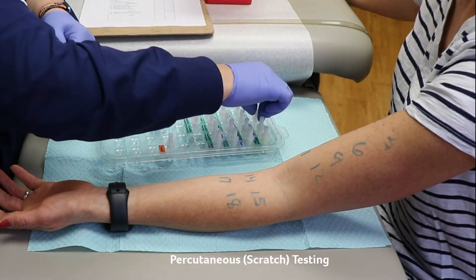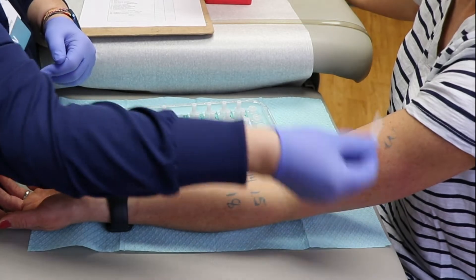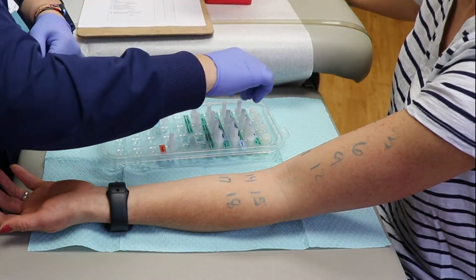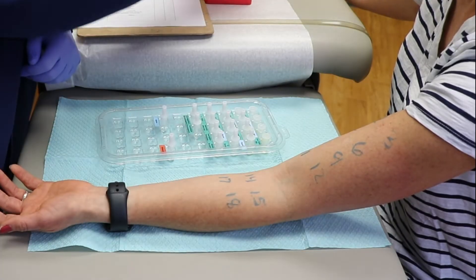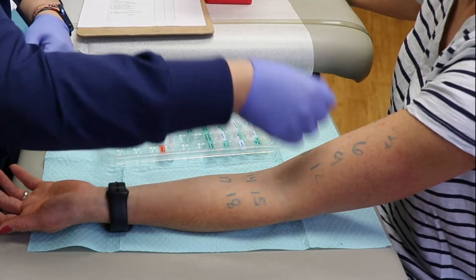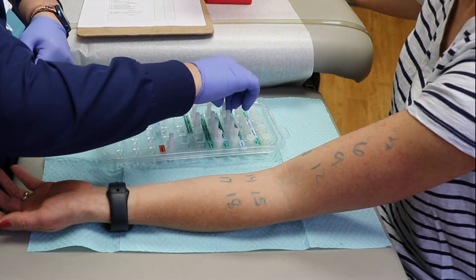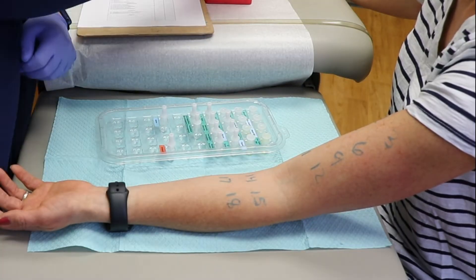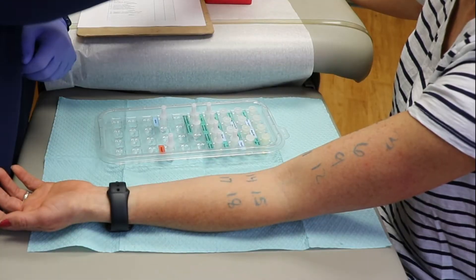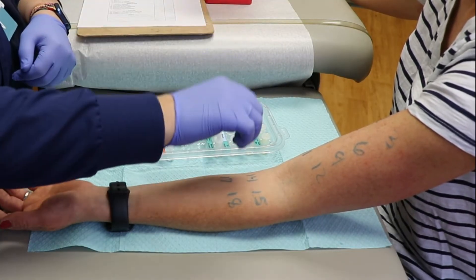Skin prick tests can be placed on the arm or back depending on patient preference and the age and size of the individual. A very small amount of allergen is put into the skin by making a small prick on the surface of the skin. The prick tests are done with a sterile disposable plastic prick test device that looks like a small toothpick. The sensation is generally not painful and only mildly uncomfortable.